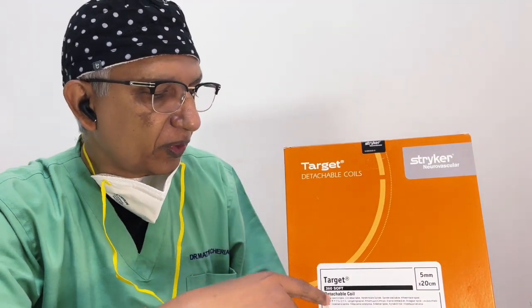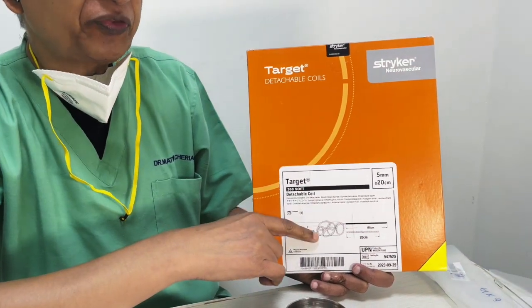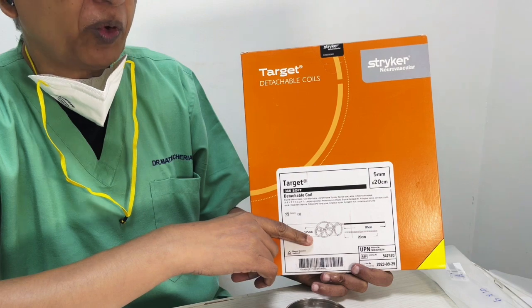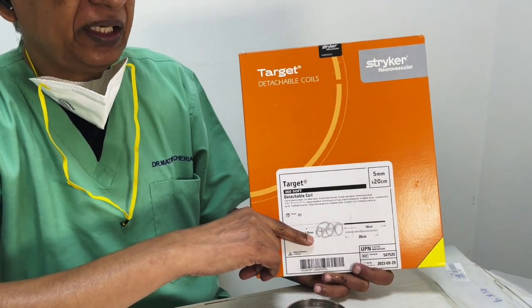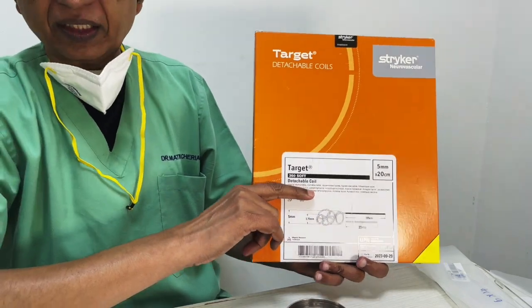So this is a soft coil. This is a 360 coil. It's a great coil for the first few framing coils. But after that, try to pack it up with more helical coils, because packing density is better with helical coils, and the better the packing density, the less the recurrence.